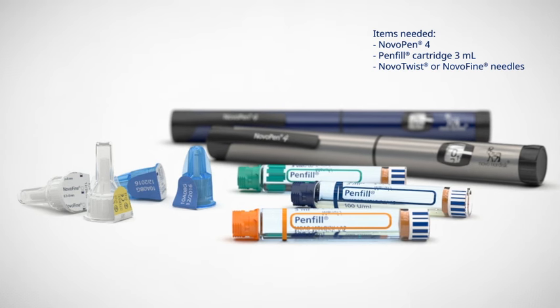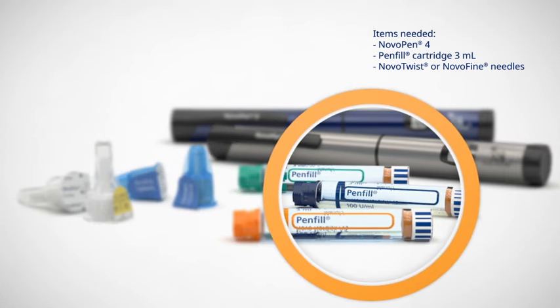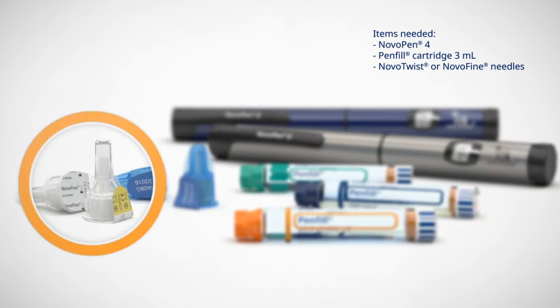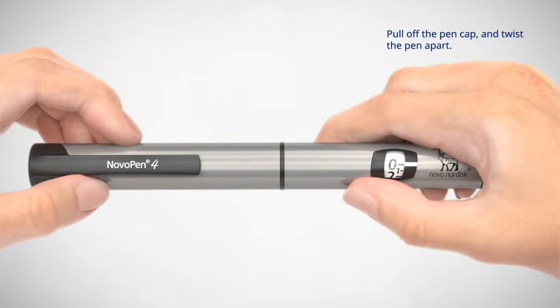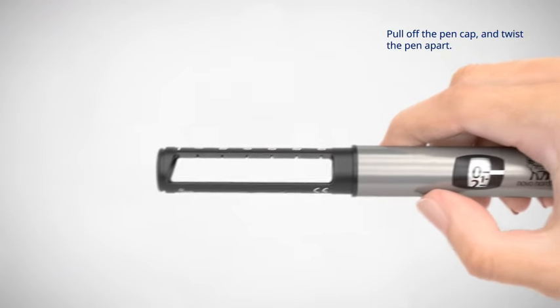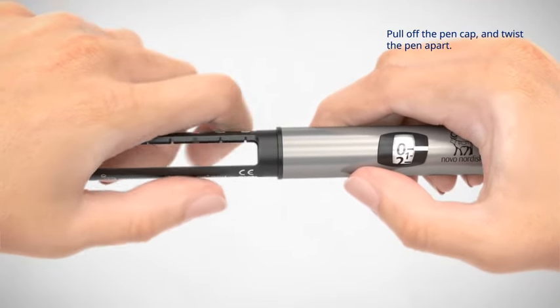NovoPen 4 is designed to be used with pen fill cartridge 3 ml and Novo Twist or Novo Fine needles. To prepare NovoPen 4 with a new pen fill cartridge 3 ml, first, pull off the pen cap and twist the pen apart.